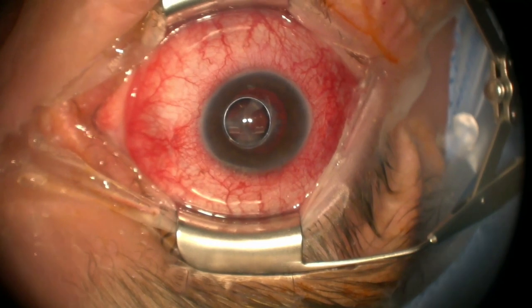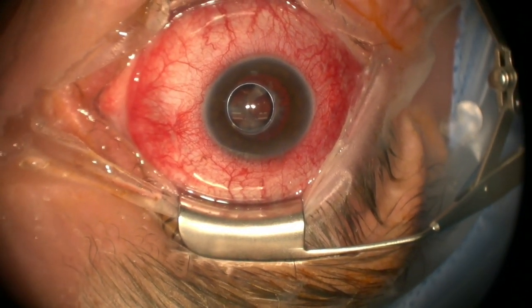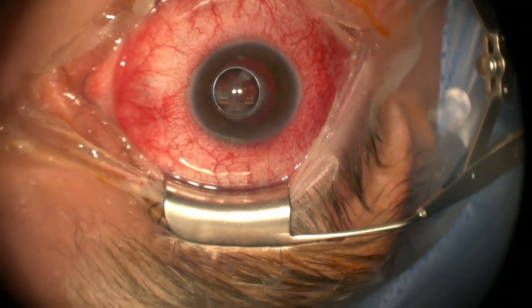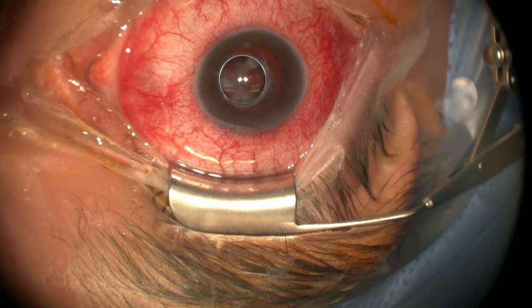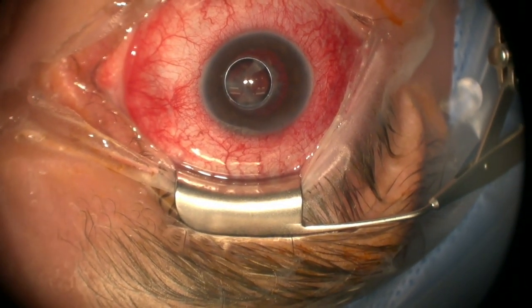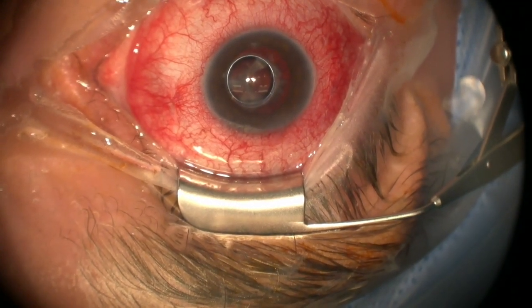And there's our guy. He is aphakic also. There's been quite a bit of contraction there on the anterior capsule. It does have a capsule opening in the middle. That's left like that purposely by the prior surgeon, I think, to facilitate a sulcus PCIOL at a later date, which we are not doing today.